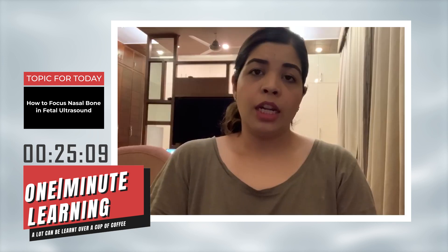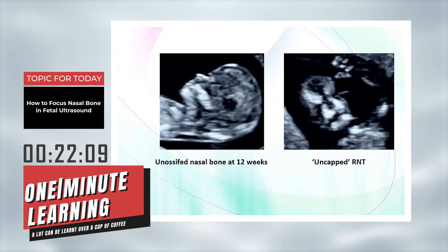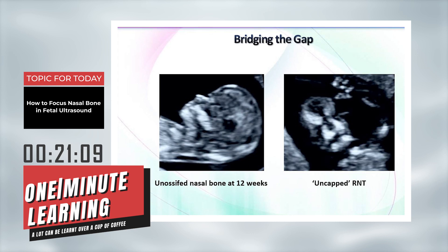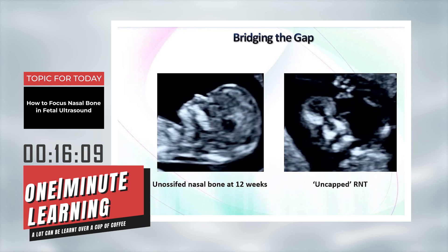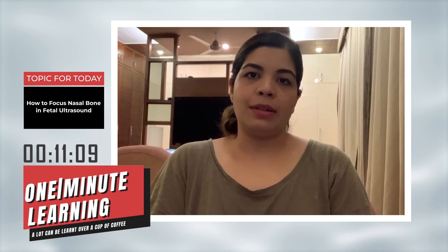Now, if the nasal bone is not present, this retronasal triangle will be uncapped, and it will give us a diagnosis of absent nasal bone or unossified nasal bone with confidence in the first trimester.